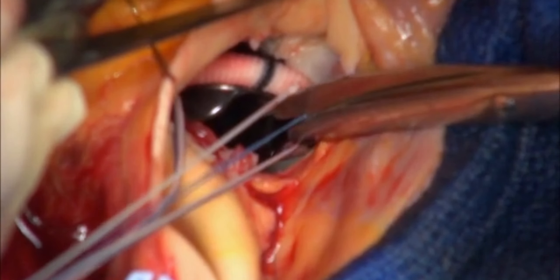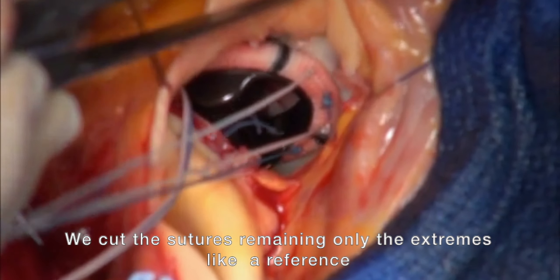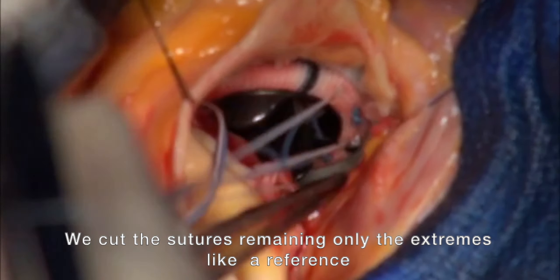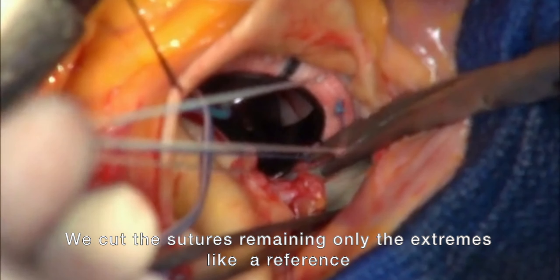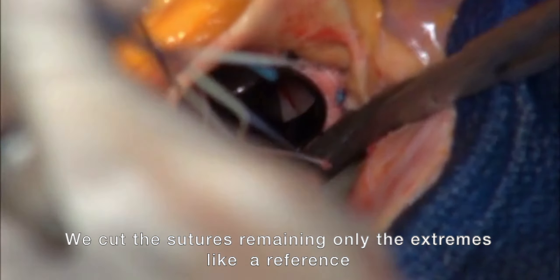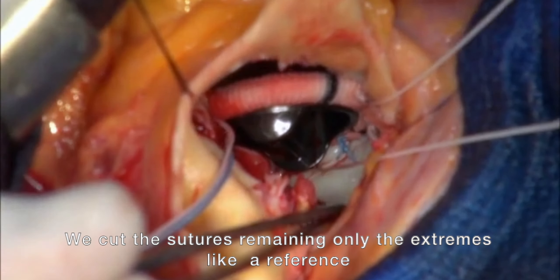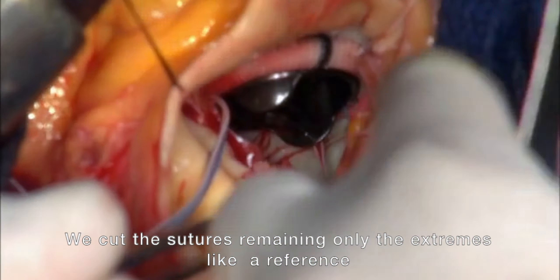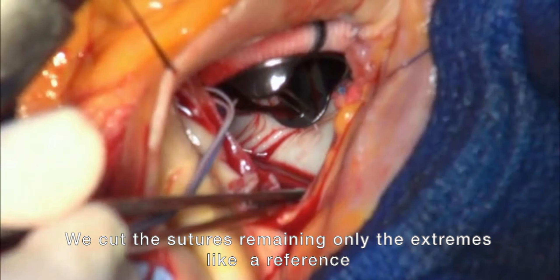We cut the sutures, retaining only a few strings as reference. It is important to avoid the use of an excessively large prosthetic mitral valve because it fills the left ventricle and does not leave space for the prosthetic aortic valve.